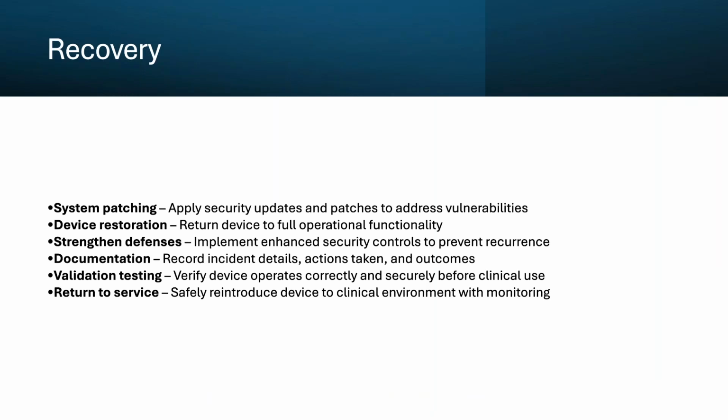Recovery. Once we've contained a security incident involving an outdated embedded operating system, the recovery phase is critical. This isn't just getting devices back online, it's about doing so safely. First, we apply system patching, security updates and patches to address any vulnerabilities. But the challenge with medical devices is that many embedded systems can't accept standard patches without manufacturer approval. So we must work closely with vendors to obtain validated patches that won't compromise device functionality or FDA clearance.